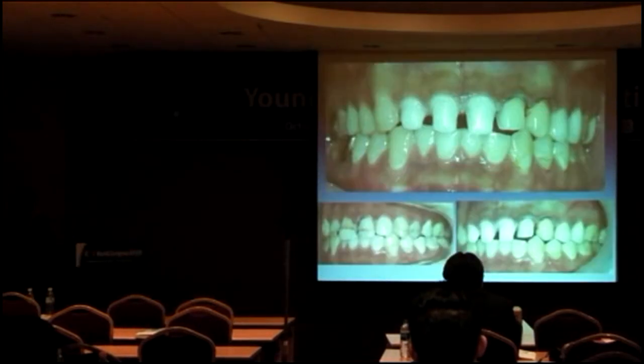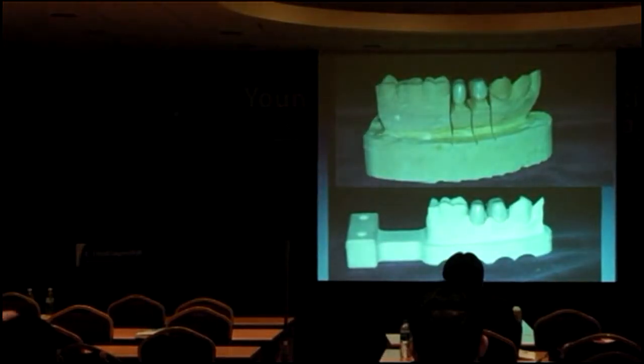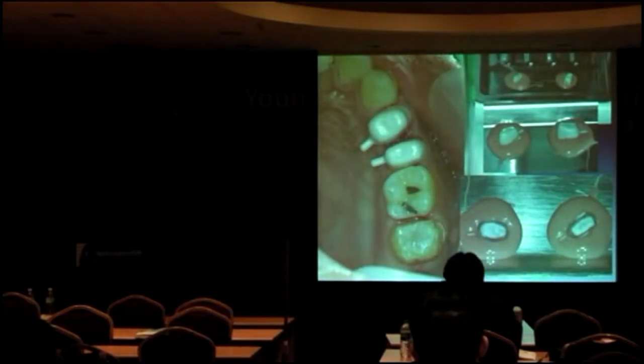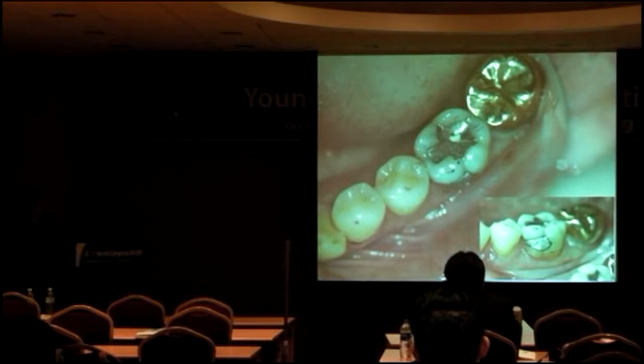Another patient needed a lot of crowns, and I prepped these posteriors, made an impression, and scanned at the same time. I tried four copings in the patient's mouth, and the posteriors as well.